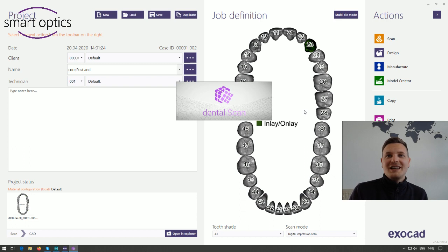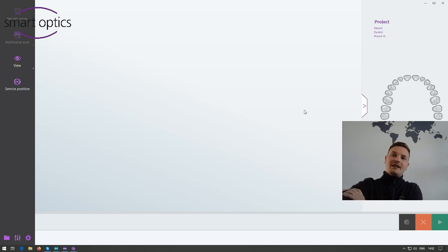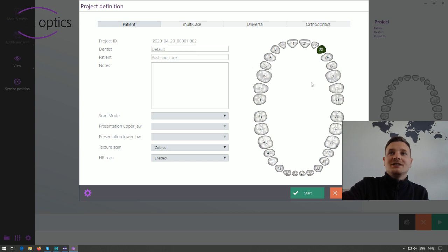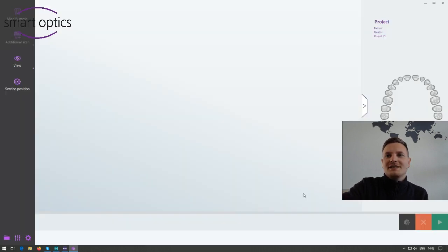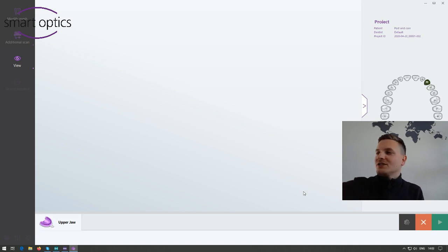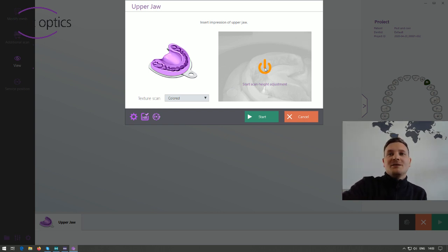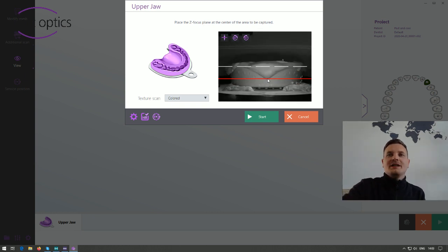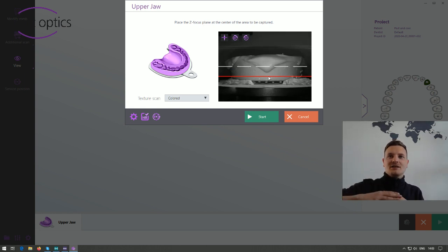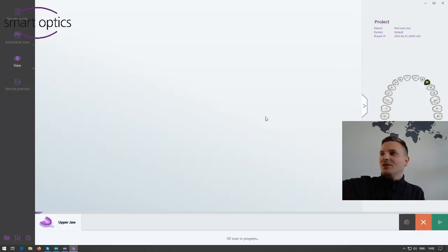We will scan with the latest version now. The scanner starts and we should create the project definition. We have tooth number 2-3, that's correct. The scan mode will be an impression, the presentation of an upper jaw will also be the impression. Color is okay as a texture and we use high resolution. I can put the impression into the scanner. Because we are using the universal plate and not the impression holder, it's necessary to adapt the Z-axis up to the top.